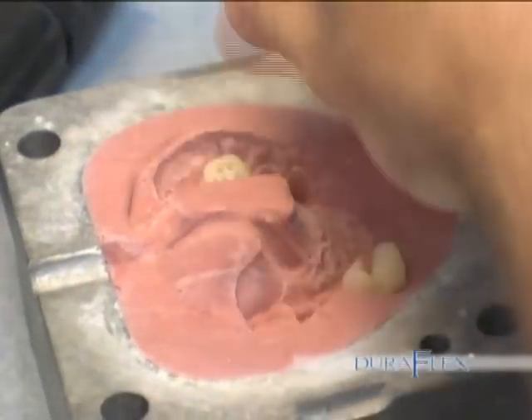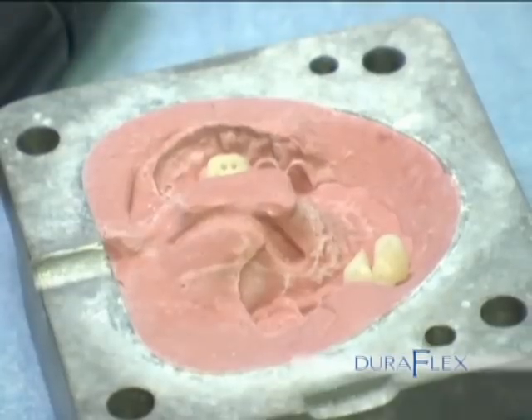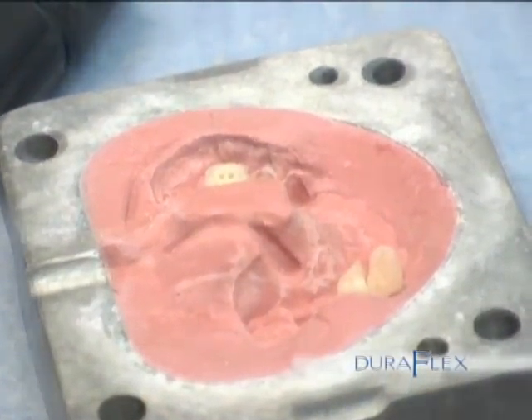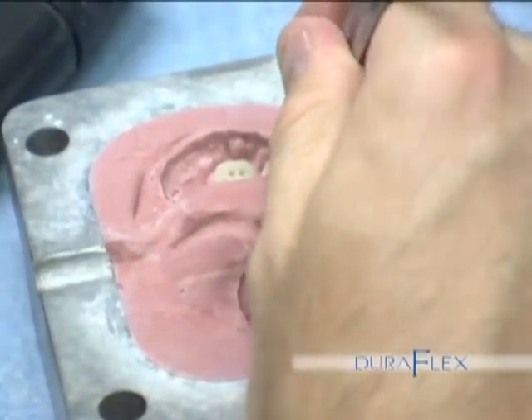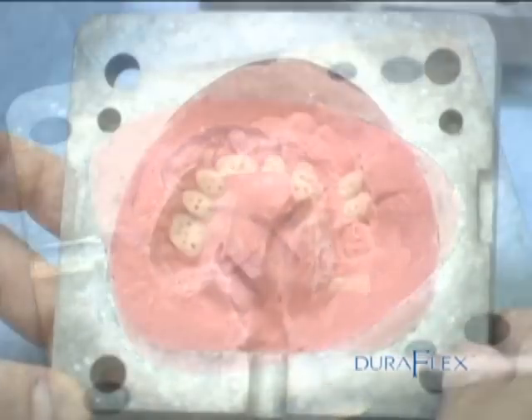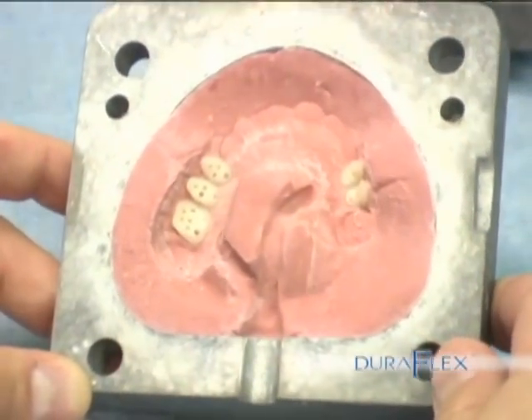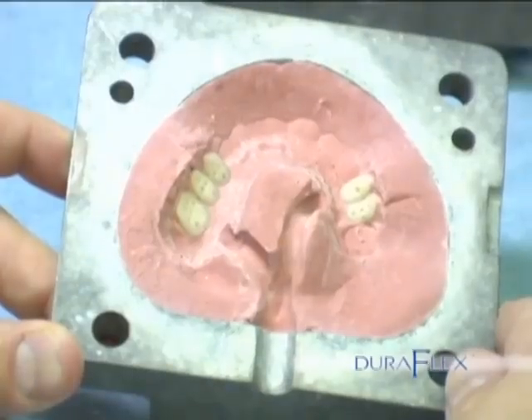Gluing the teeth. Using glue on the denture teeth, put them back into the mold. Just a small amount of glue will be adequate. Make sure the teeth are in the right spot and placed fully in position. When the glue is set, put the flask back together with bolts and tighten.